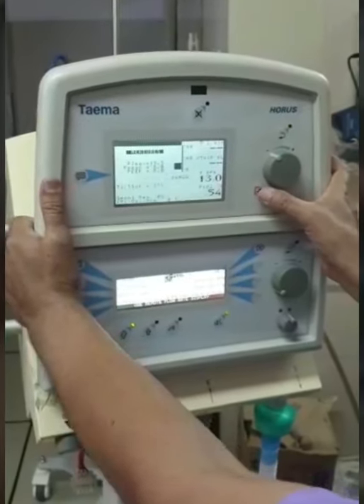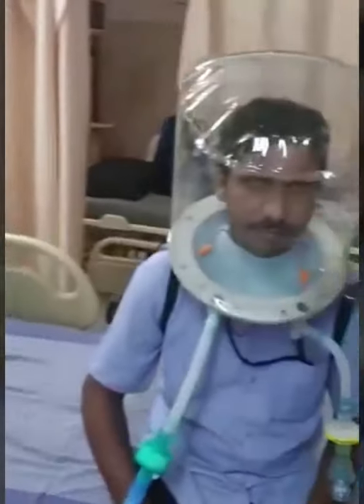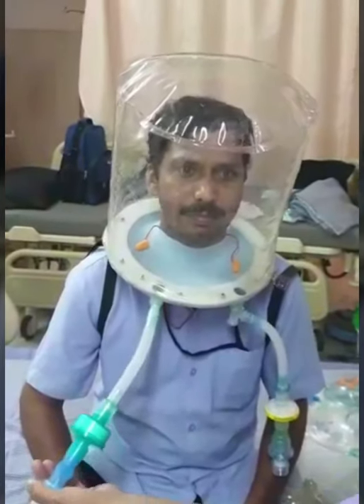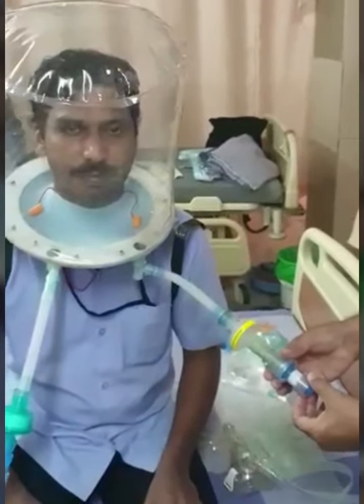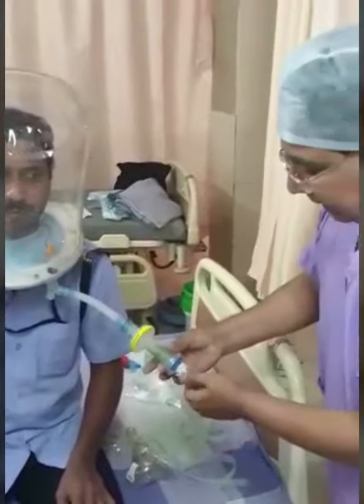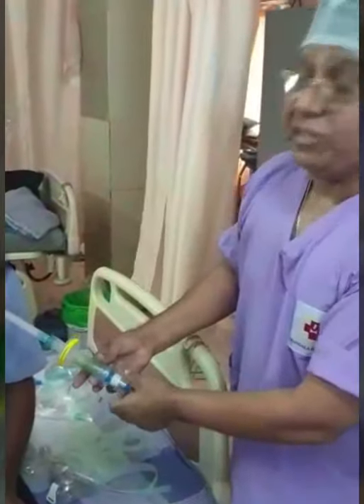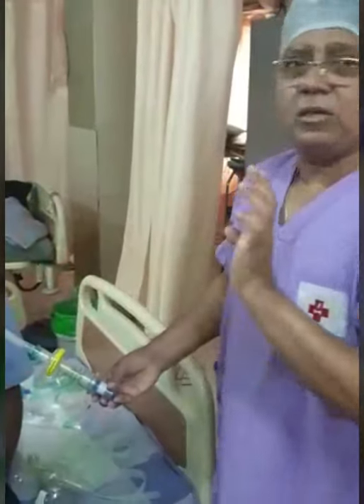This is the page to monitor. Now, if you see, the hood fixes onto the patient tightly and it bubbles up nicely. This is the inlet. This is the exhaust. I have kept this very minimal to adjust to his comfort — the mechanical PEEP valve here. I can tighten it to increase and give extra PEEP in case the patient's saturation doesn't improve, or if the patient doesn't feel adequate oxygen is being delivered.